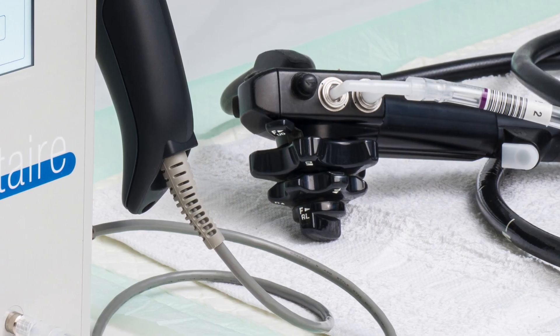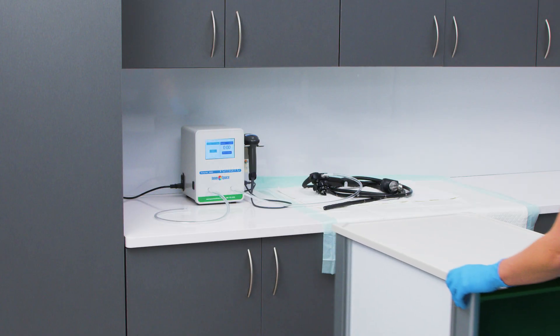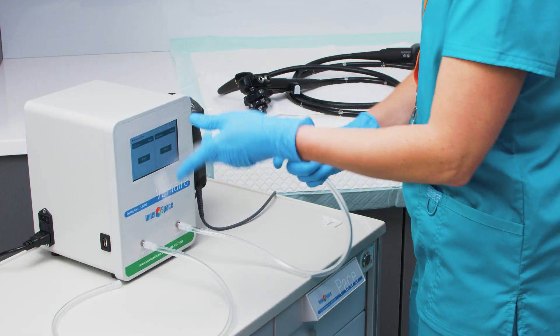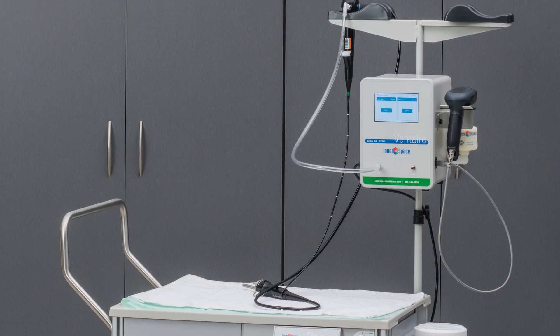The Drying Unit provides a flexible and cost-effective solution for drying a scope's interior lumens. The Drying Unit's compact size contributes to its flexibility. It can be placed on a counter, cart surface, or mounted on a wall, IV pole, or scope pole.